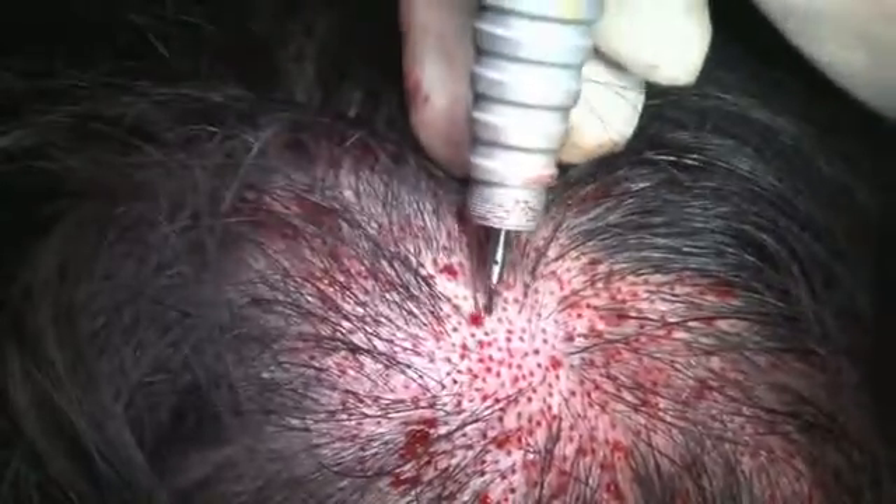Punching was done following a parallel angle of nearby hair.